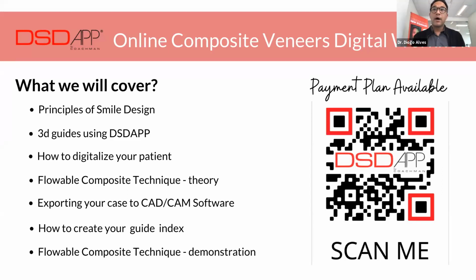Yeah, it's a course where we want you to understand the entire workflow. We want you to understand the principles of digital smile design. How can I become a digital smile designer? How can I actually take that design and bring it to reality, knowing that the patient understands how the procedure works and what the final outcome will look like? By giving you that, one of the benefits is that you will be in control of the entire project.